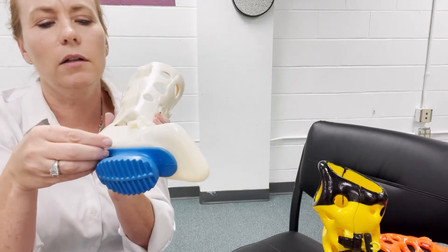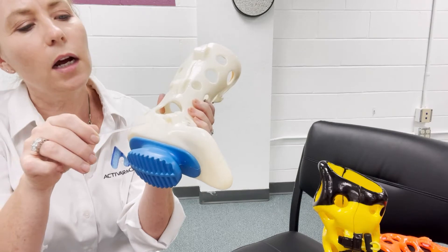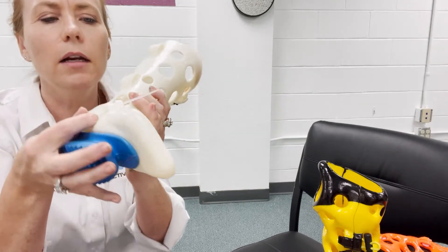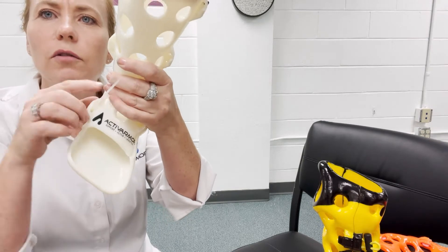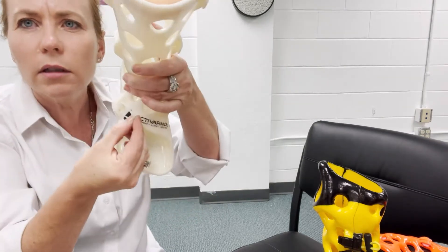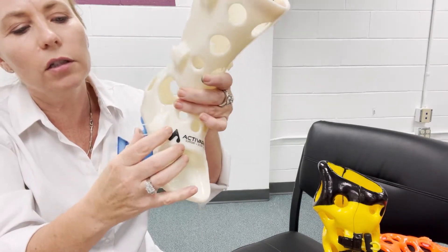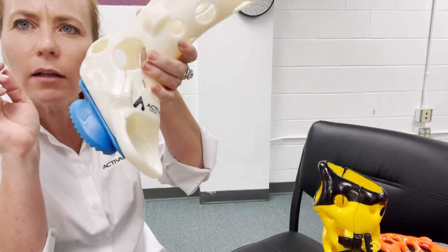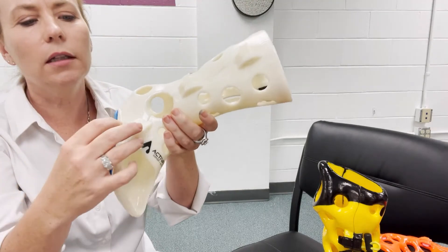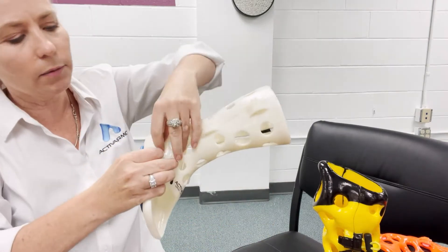I'm going to slide the zip tie up through the holes underneath the hook side, just like that. On the other side, see how there are two holes — I'm going to curve the zip tie back around and go back in through the other hole, so it's coming out the other side. Then you're going to take this end and feed it into the zip tie head.